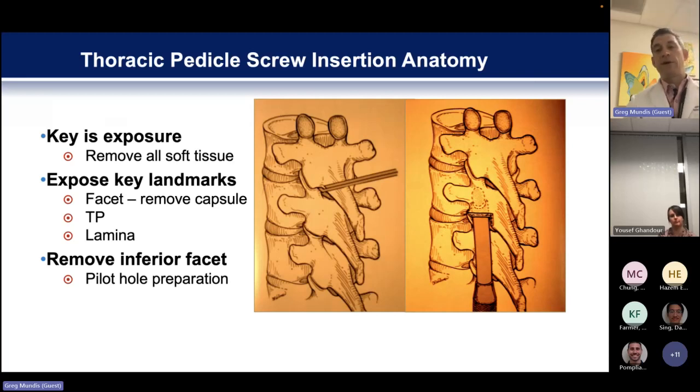When doing freehand screws, your exposure is absolutely critical. If you don't have good exposure, you have the potential to deceive yourself. When you're putting in freehand screws, having all those anatomic landmarks — they're all little clues as to where the pedicle is. All these landmarks have to give you an individualized sense of what's happening under the surface topography. Exposure is key. You want to make sure that you've exposed the facet joints, the transverse process, and the lamina at every single level.